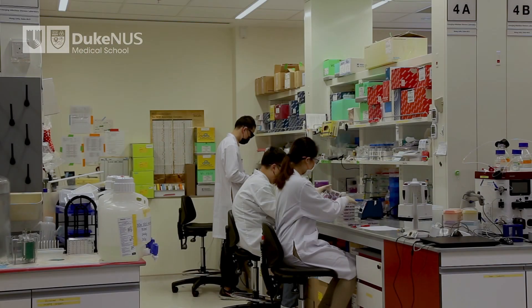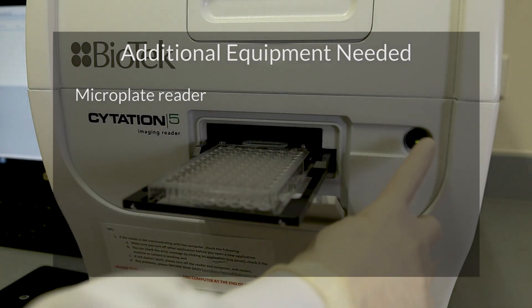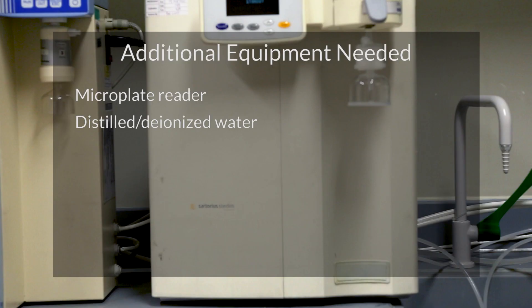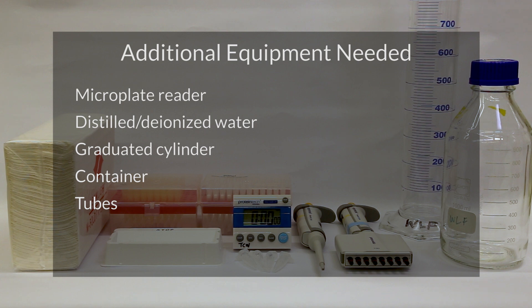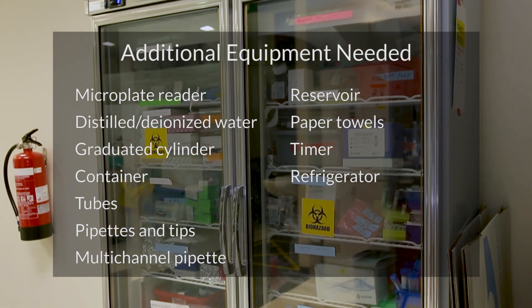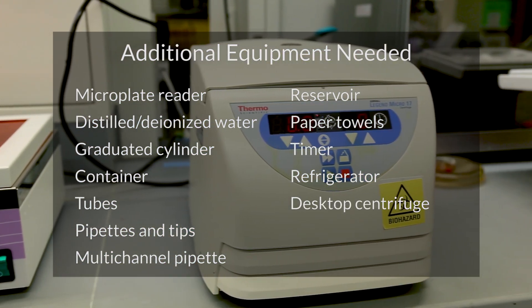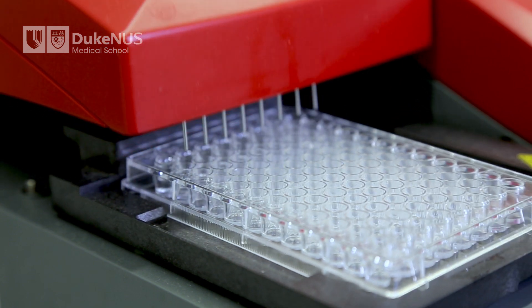In addition to what is provided in the kit, you will need the following laboratory equipment to run CPAS: a microplate reader with a 450 nm filter, distilled or deionized water, a graduated cylinder, a container to store the wash solution, tubes to aliquot or dilute samples, 10 µl, 200 µl, and 1 ml pipettes and tips, 200 µl multi-channel pipettes, reagent reservoir, paper towels, laboratory timer, refrigerator, desktop centrifuge, 37°C incubator. Having a microplate washer is also helpful and recommended.